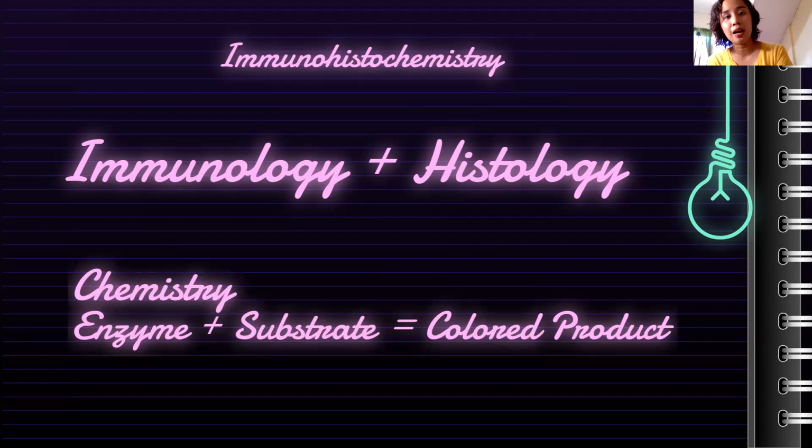And another principle involved is chemistry. So guys, enzymes are used as a label on your antibodies. They are attached, or conjugated, to your antibody. For example, your antibody is a Y, and it has a label attached, so that your antibodies could be easily detected.